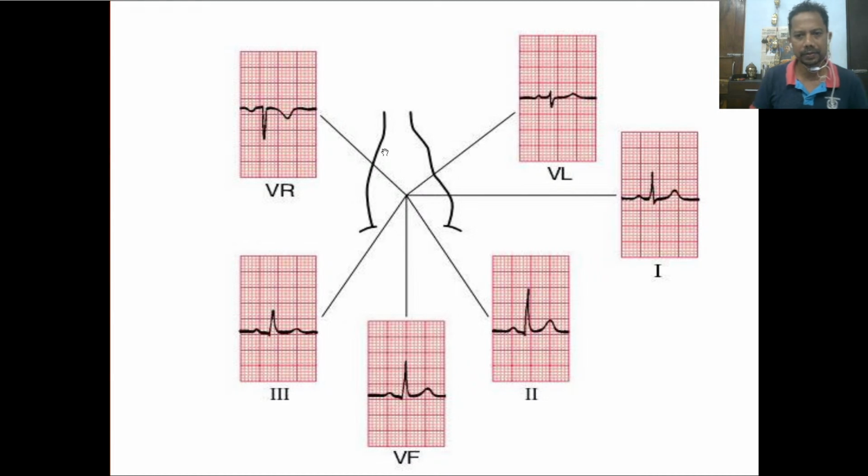Now see, if you observed, I said negative QRS, but it is not like that. There are different types of QRS complexes. If there is this, this is a small q. You have to learn to recognize this small q, this initial negative deflection. This is a P wave, this is a small q, this is an R wave, and if there was an S wave, it would have been like this. In this there is an S wave. P wave, R wave, S wave.